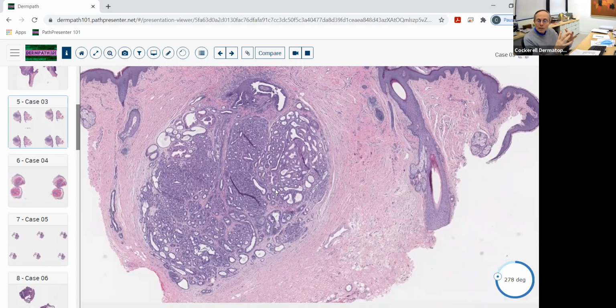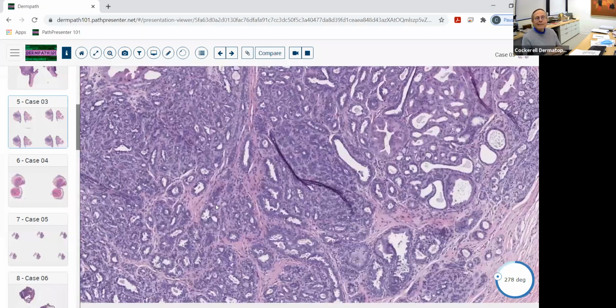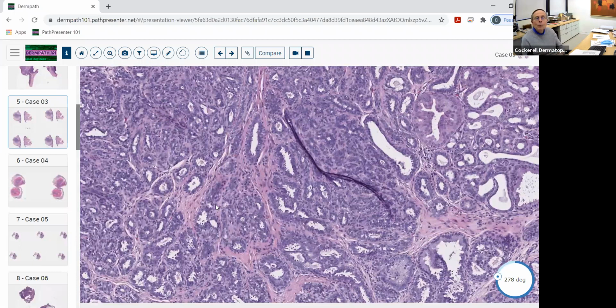We're down in the dermis. And there's maybe some smooth muscle bundles here. There's some benign apocrine cells over here, like apocrine sweat glands. This may be from an area such as near the genitalia. And this looks almost like a cyst. And these usually are submitted as rule out cyst, rule out some kind of a dermal neoplasm, if you will.